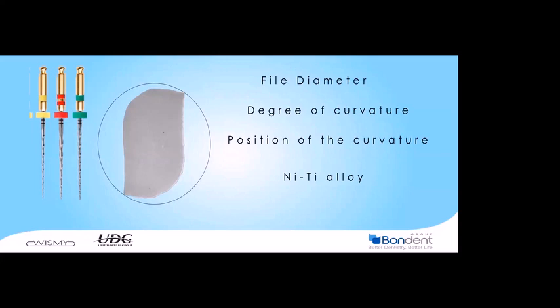On the contrary to torsional stress, in cyclic fatigue the smaller files have better resistance. So, if we have a severe curvature, in order to decrease the cyclic fatigue stress, we are going to use small files, or files with small tapers. We can use files with 04 taper or 02 taper instead of using files with 06 or 08 taper.